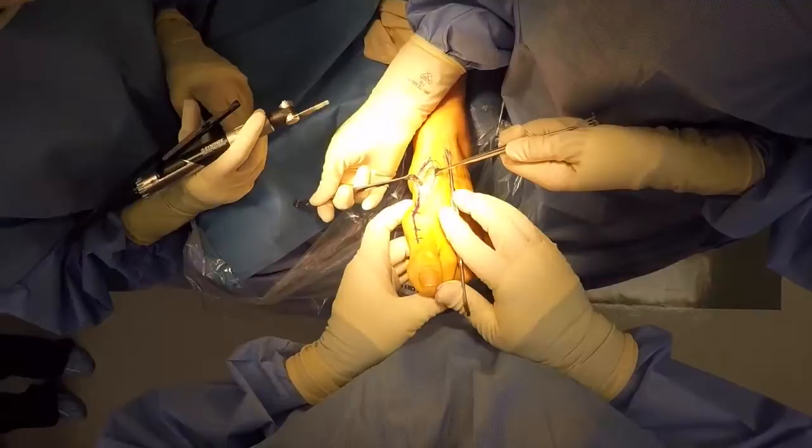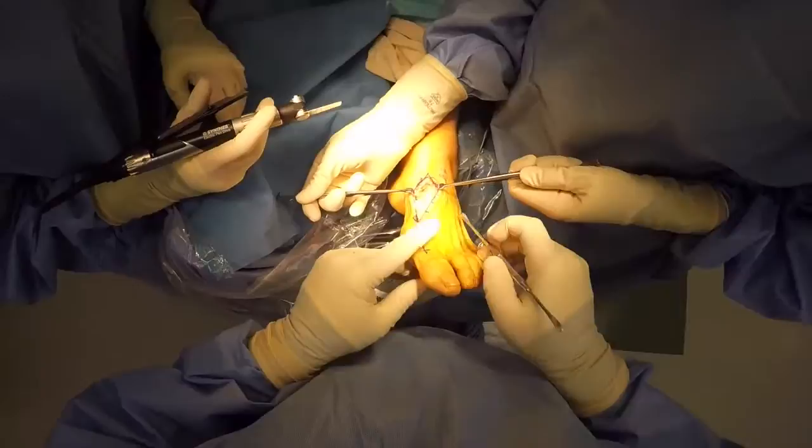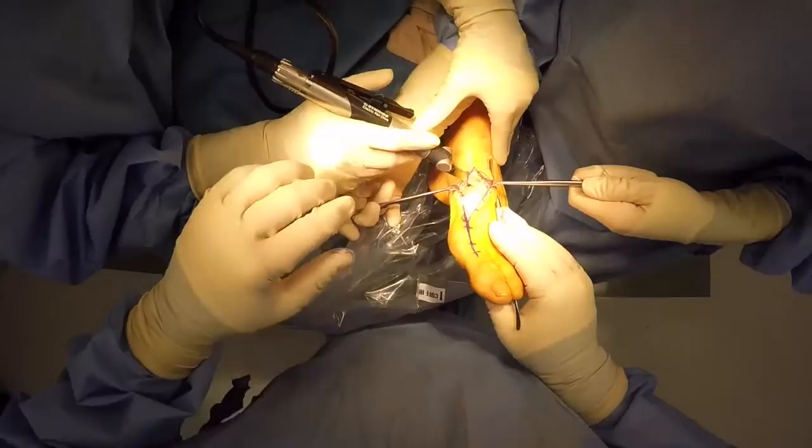So once we have our periosteum freed and we have our joint exposed and we're prepping for removal of the cartilaginous surfaces, we use a freer elevator here. Here we are identifying the joint, and we place the freer elevator along the course of the second metatarsal so we can use it as a guide with our saw placed perpendicularly to the second metatarsal.